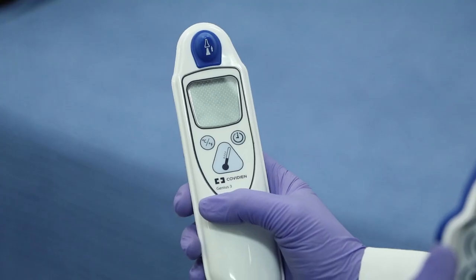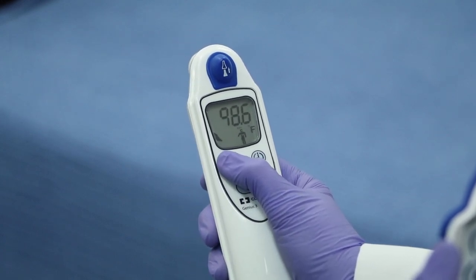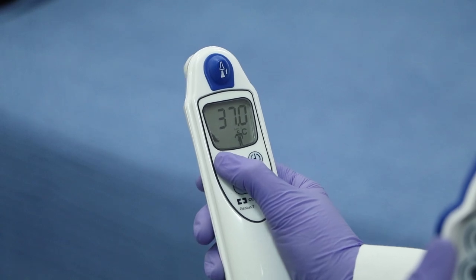To recall the last temperature, press and release the scan button. To toggle between Celsius and Fahrenheit, hold the CF mode button until the reading changes.